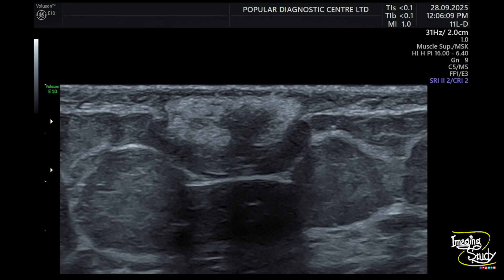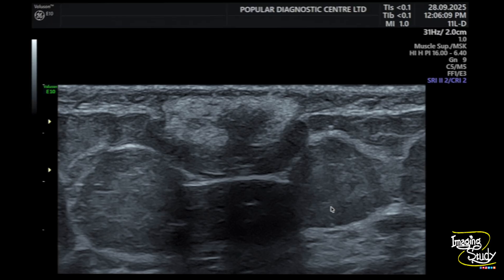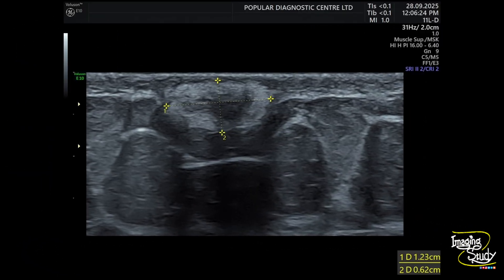Here's the picture — you can see this lesion with peripheral hyperechoic thick area and the central hypoechogenicity. There is no surrounding architectural distortion also. Here's the measurement: it's slightly more than one centimeter in length.